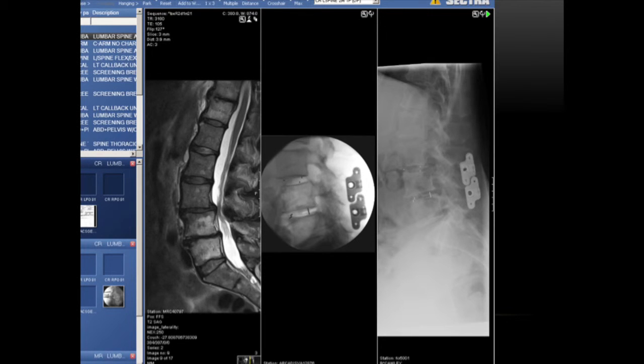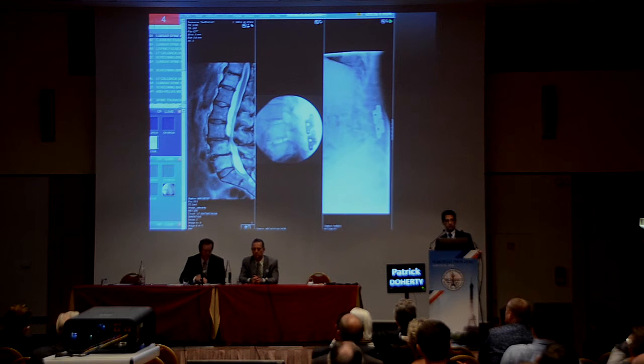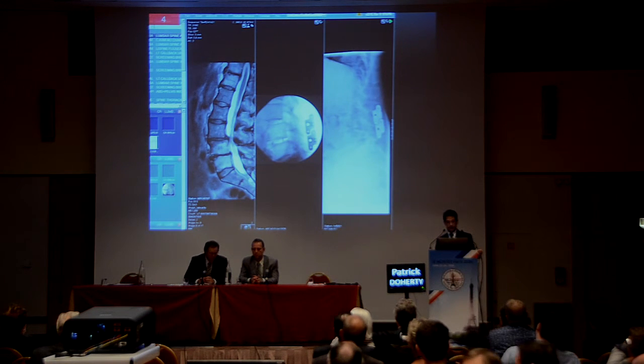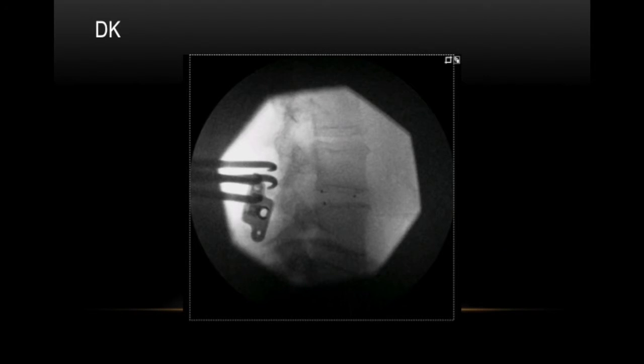The intraoperative film is in the middle, and the 3-month film is on the right side. She actually subsided a bit, which is to her advantage because she's actually corrected some of her curvature, which is a good thing. You can see that the interspinous devices are closer on the right-sided film. And clinically, again, no back pain, not no, but much less back pain and no radicular pain.